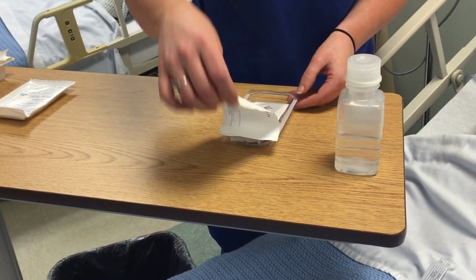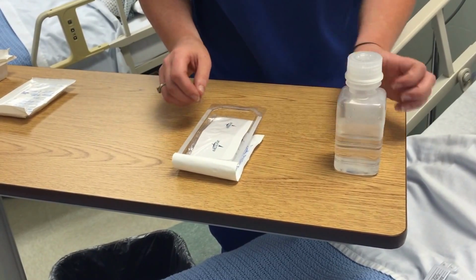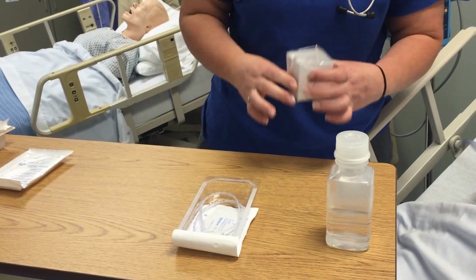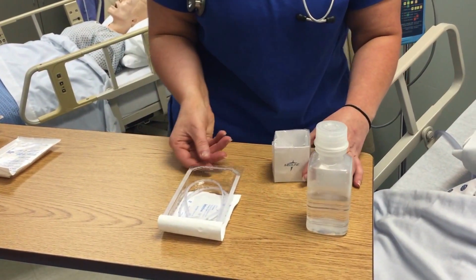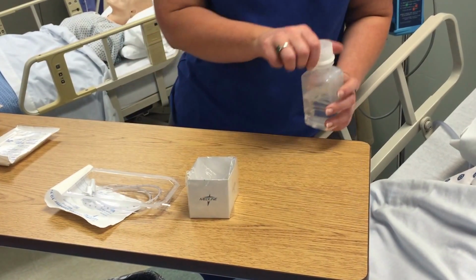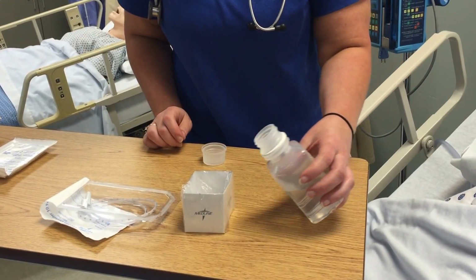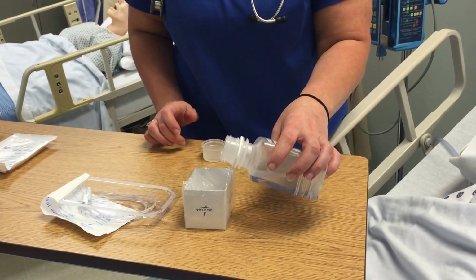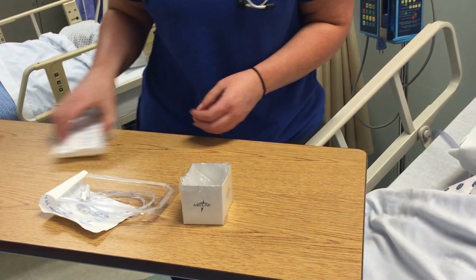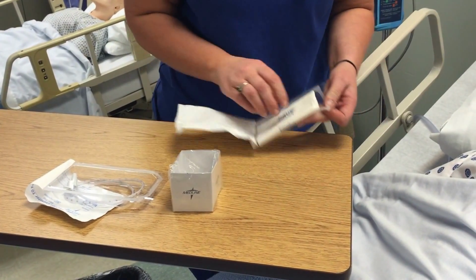Okay, I'm going to open the catheter set. You just pick this out, straight out, and open the little box. Set it right here. Okay. All right. Okay, over here. Set up, and then just pour some here. All right. And then open our sterile gloves.